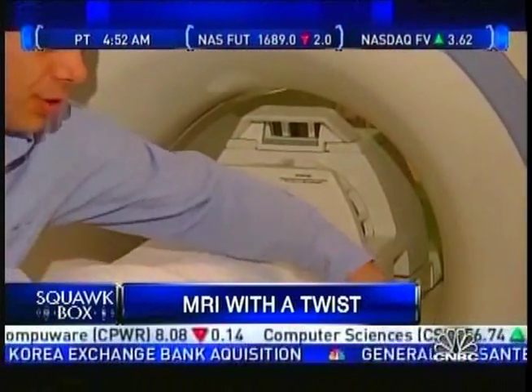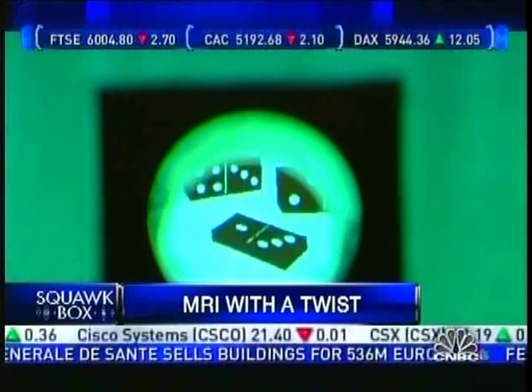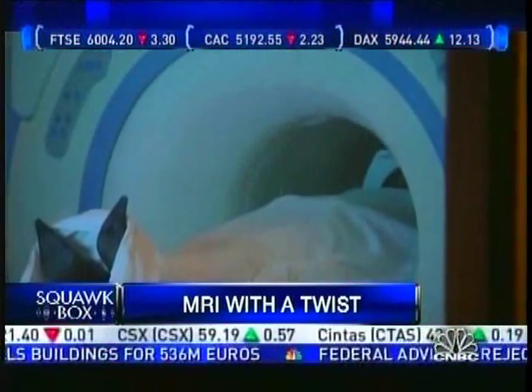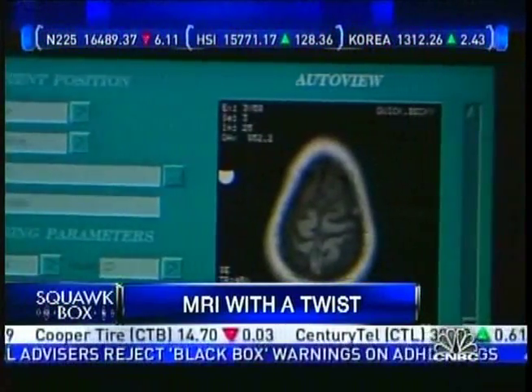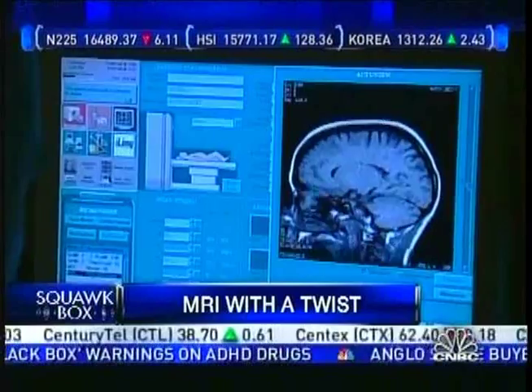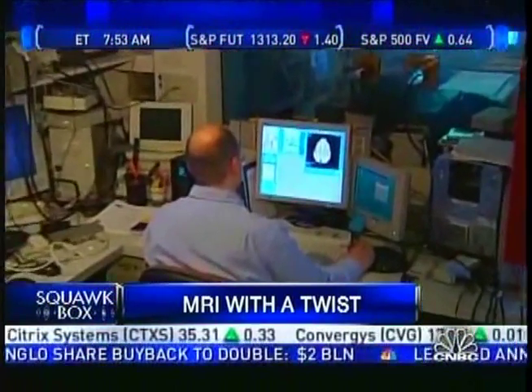How you doing so far, Becky? Okay. The machine flashes pictures before me as I'm asked to tell a true story in my mind. Next, they tell me to tell a lie while the pictures start flashing once again. Computers record and store my mind's every thought. Then Dr. Hirsch and her team analyze the results.